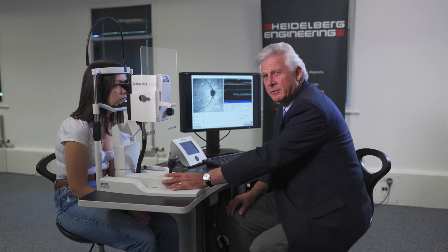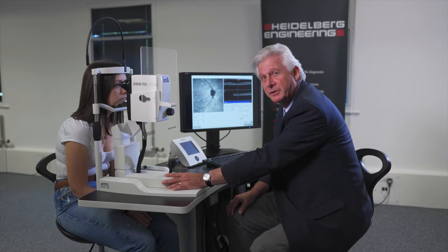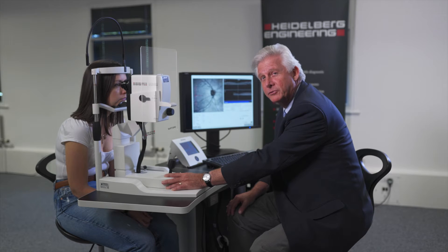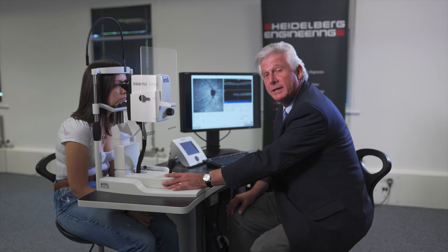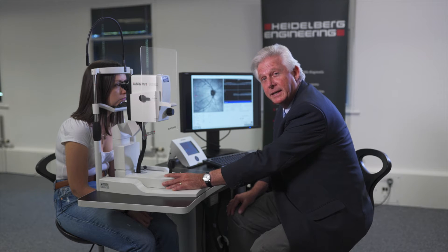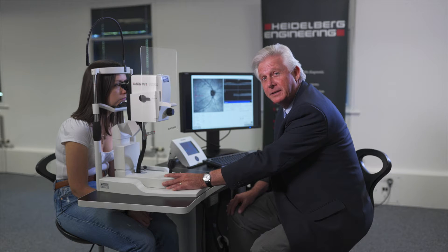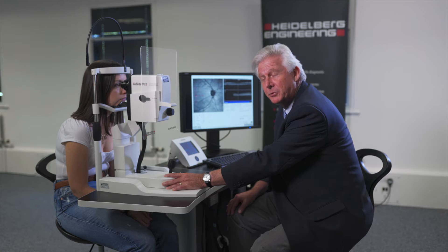What we have here is an anatomic positioning system. We're going to automatically identify the fovea and then four primary points of Bruch's membrane opening, which should be the true anatomic disc margin, and we're going to do this before any scanning. The reason is that everybody has a different orientation and a different angle of the fovea to the disc, so we need to isolate this before we start scanning.